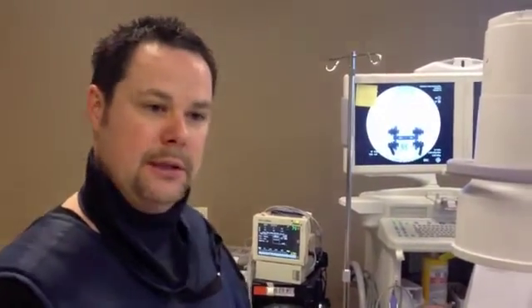Hi, this is Dr. Torney Junkin. We're going to do a medial branch block. This is a patient who's had a previous fusion, so we're going to actually block above the fusion, and then at the level there'll be kind of a medial branch block in that area.